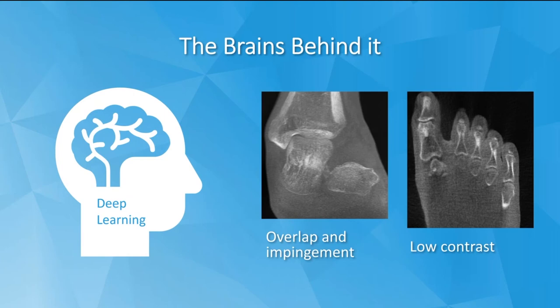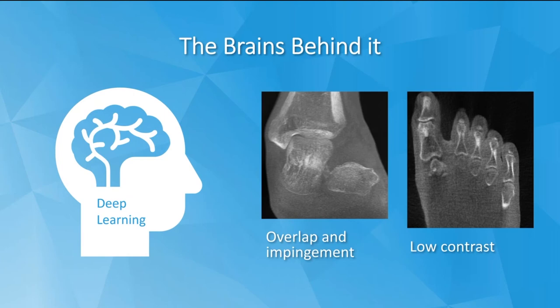Segmentation of anatomy can be difficult, especially when you have overlap and impingement or low contrast due to low-dose modalities. That's why we use deep learning.